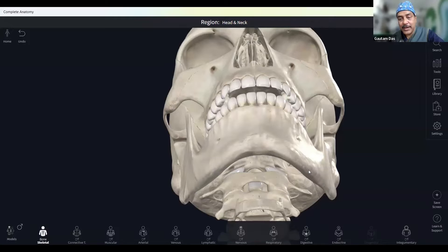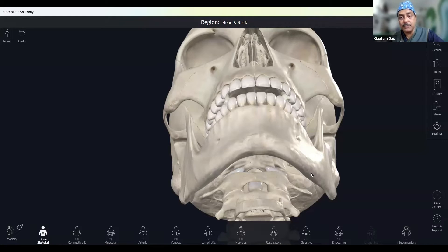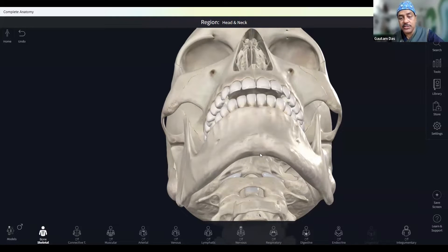You need to make the C-arm caudally tilted. How much? It depends on how much neck extension you have. If you extend more, you need less caudal tilt; if you extend less, you need more. It can be somewhere between 15 and 60 degrees — all depends on the neck extension. Even then, you still cannot see the foramen ovale. This view is called the submental view.